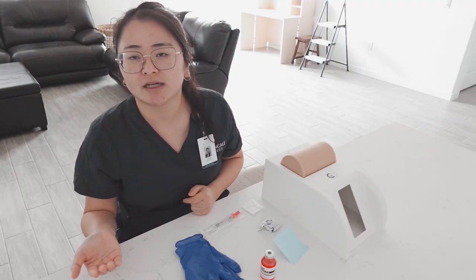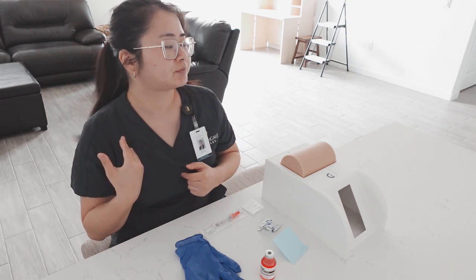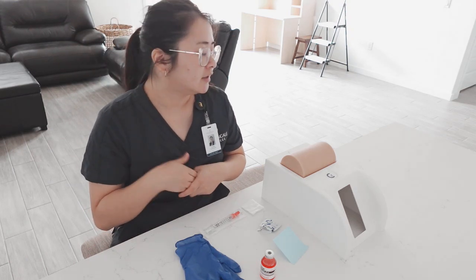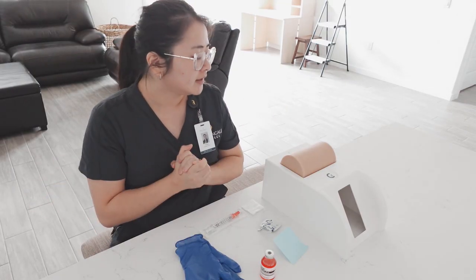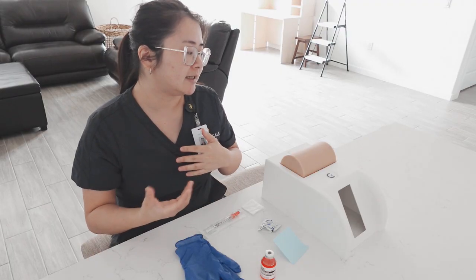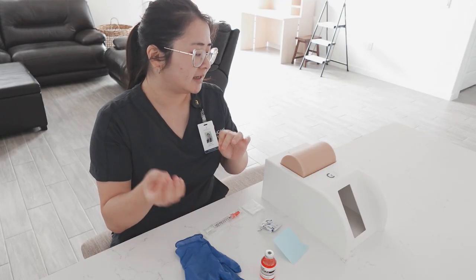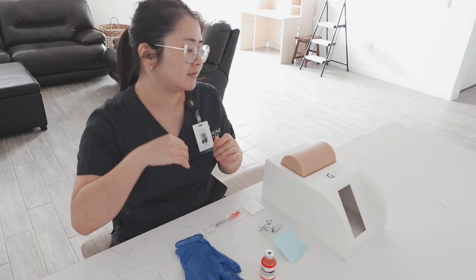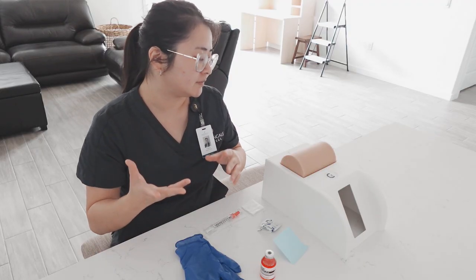This is where I verify the medication against the MAR a 2nd time out of 3 times. It is the correct medication. Okay, Mr. Smith, before we proceed, I have to tell you everything we're doing today. So the doctor has ordered that we do a tuberculin skin test, which is a TB test. And what's going to happen is it is a delayed hypersensitivity lymphocyte reaction.